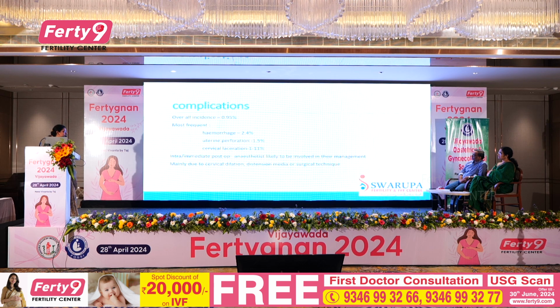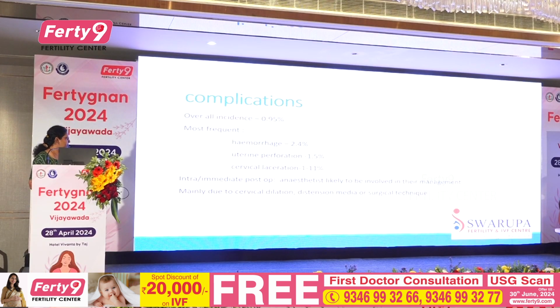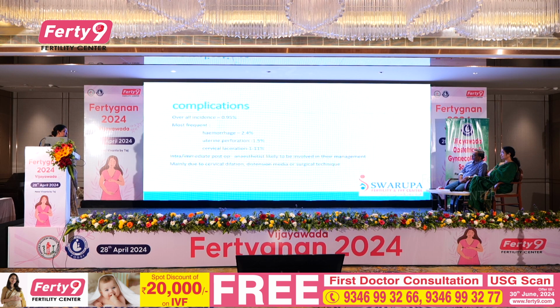And the most frequent of them are hemorrhage, which accounts for 2.4%, uterine perforation, which accounts for 1.5%, and cervical laceration around 1 to 11%. For intra or immediate postoperative complications, you have to involve an anesthetist also in their management. These usually mainly occur due to cervical dilatation, the distension media, and the technique you are using.